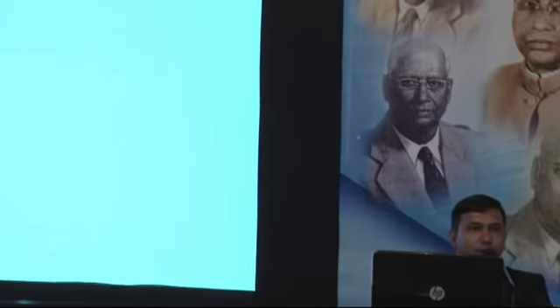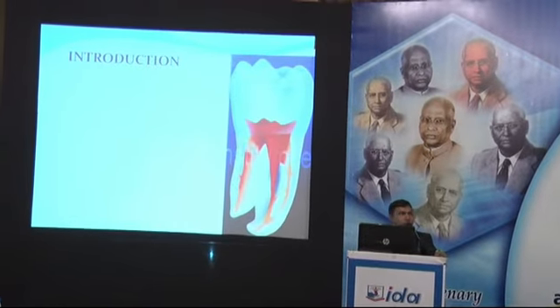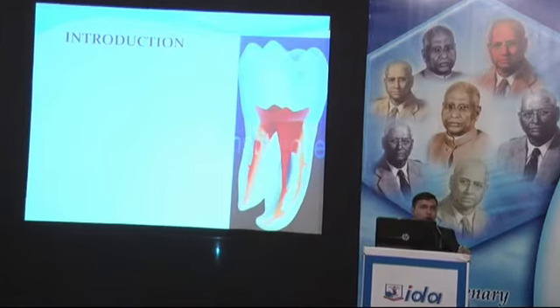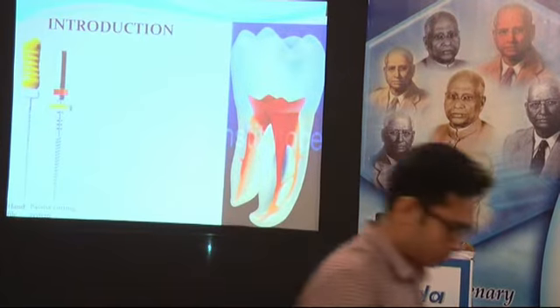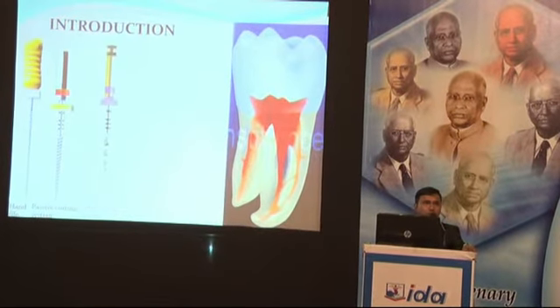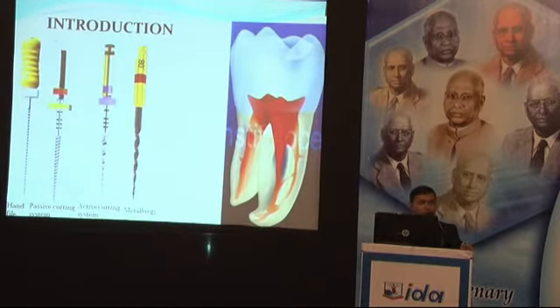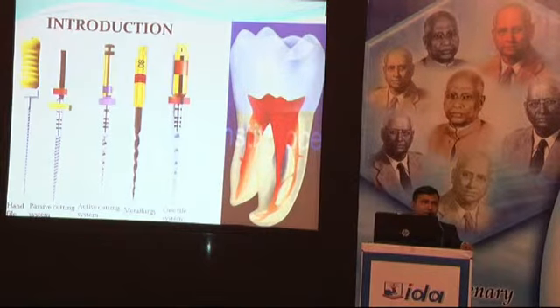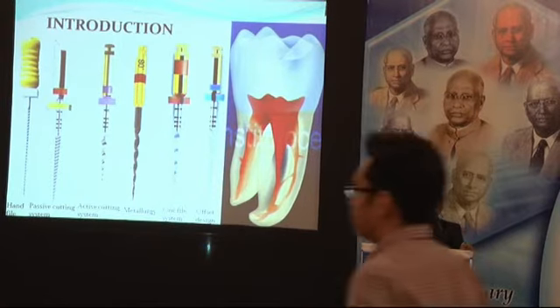One of the most important stages of root canal treatment is shaping, which is a mechanical debridement procedure that prepares the canal for three-dimensional obturation. For this reason, various instruments have been developed to minimize procedural error and to save time. The nickel-titanium rotary endodontic instruments have various advantages over traditional hand instruments because of continuous modification of their design characteristics. My motto is to highlight the basic design features and their correlation, to help the operator choose the right instrument for every case.